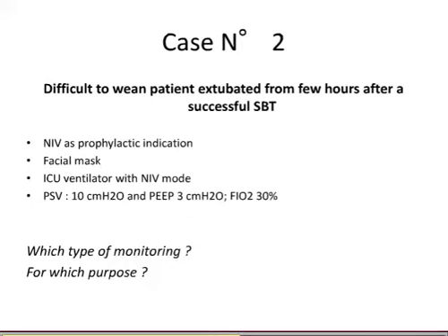Okay. I would try to look at the respiratory-related excursions of the central venous pressure as a surrogate for esophageal pressure, which I'm too lazy to use. That would be a good way to see whether the PEEP level and the pressure support would be enough, and you don't need to put any new lines in. Isn't that the problem here? Okay.